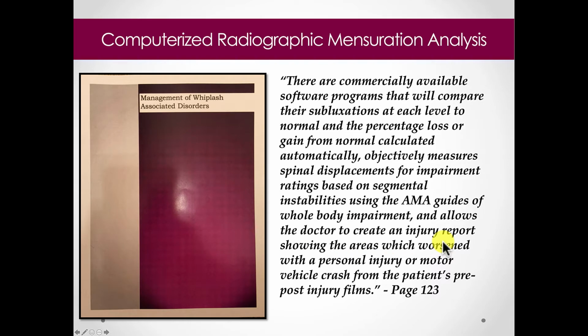we probably have already reviewed that. If you're watching this, you've already been trained. With that being said, I'll just go ahead and read this to you. There are commercially available software programs that will compare subluxations at each level to normal and the percentage loss and gain from normal calculated automatically.